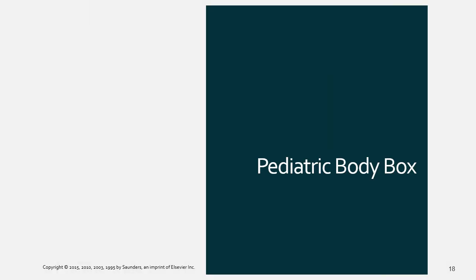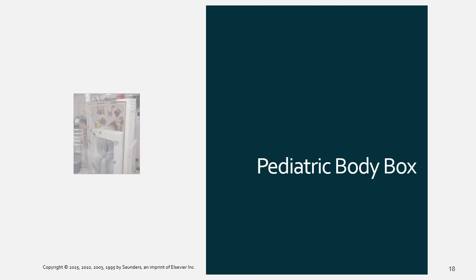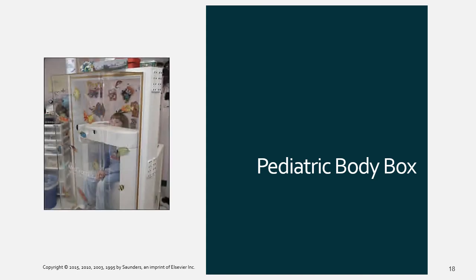Let's talk a little more about a pediatric body box. As you can see, the seat is adjustable. It's comfortable. There are stickers on the outside and on the inside to make a child more comfortable while they're enclosed in the body box.